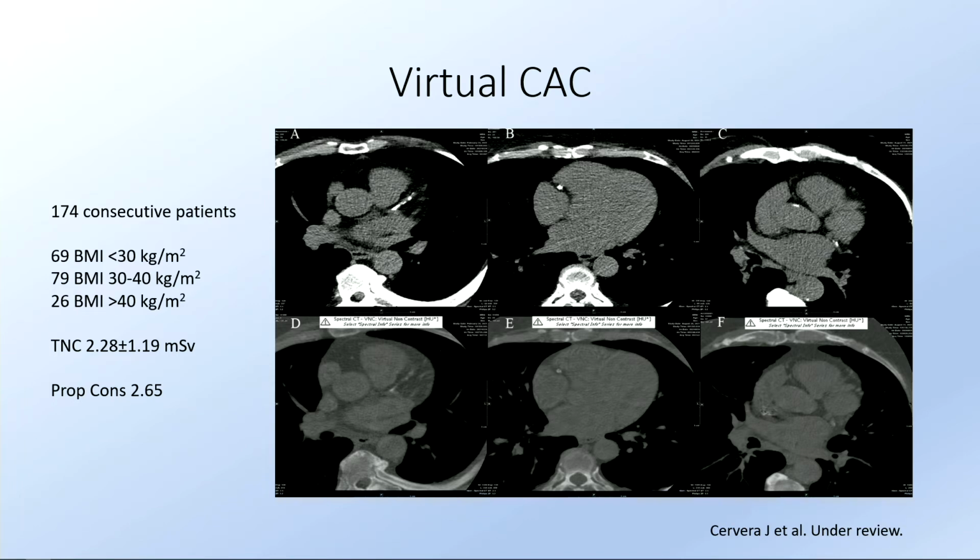So calcium score, I think, has a lot of value, not only to identify if the scan will be diagnostic, but it also tells you a lot about the burden of disease of your patient. So it means a lot for prognosis as well, as we saw from data from Mortensen and we know from many other papers. But what happens is that you need to do an extra scan.